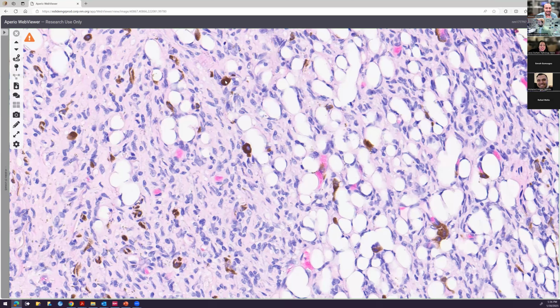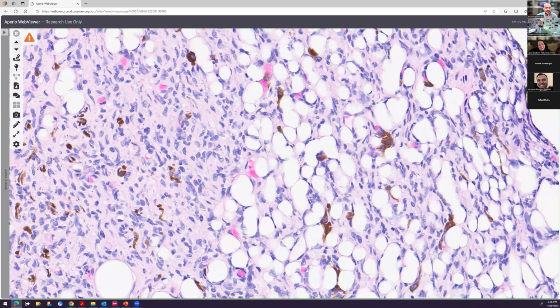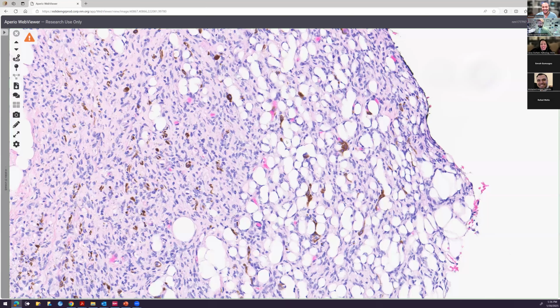If we don't want to neglect giving people their due, I suppose. It's called a Bednar tumor. So it's named after a guy named Bednar, I guess. But anyways, so pigmented DFSP. This is kind of a big thing, all right? Because it's a skin tumor, you see melanin pigment, and well, it's got to be melanoma, right? You can get pigmented DFSPs. Noted. Cool. All right, I think that's it for that.